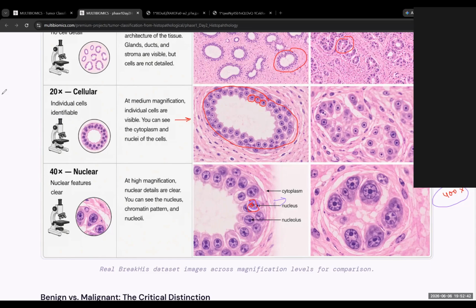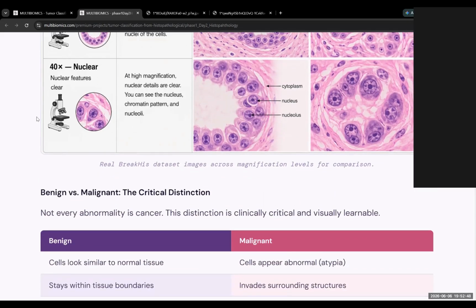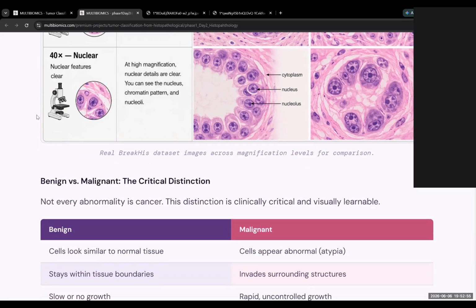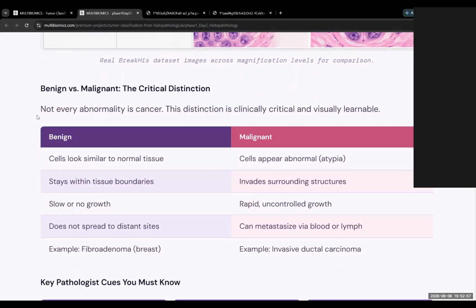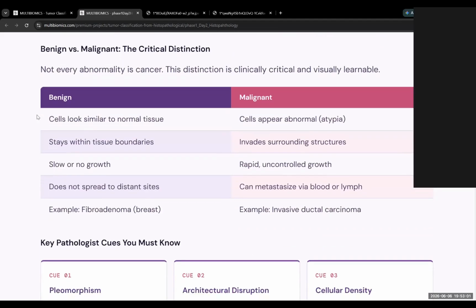It is common sense, right? We can see both at the mid magnification level. Even I was thinking the higher the magnification, the better the result, but I badly failed at 400x. Obviously there were other reasons also. I learned from my mistakes, so I'll tell you the other mistakes later on. But magnification also plays a very important role.